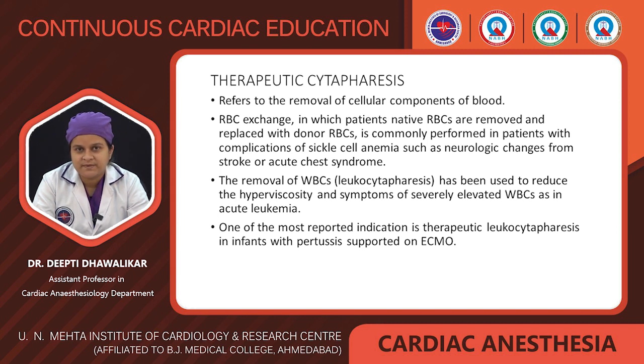The removal of WBCs, called leukocytapheresis, has also been used to reduce the hyperviscosity and symptoms of severely elevated WBCs as in acute leukemia. One of the most reported indications is therapeutic leukocytapheresis in infants with pertussis supported on ECMO. These infants usually have severe pulmonary hypertension and refractory cardiogenic shock.